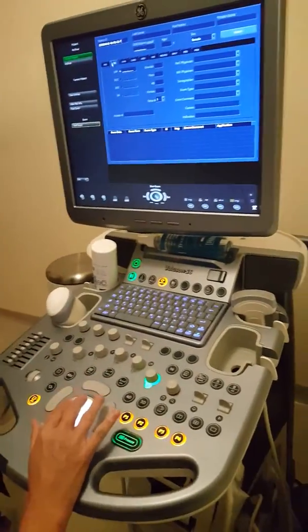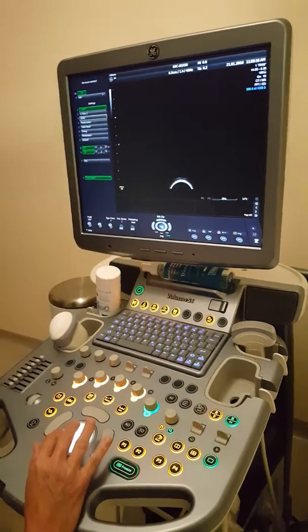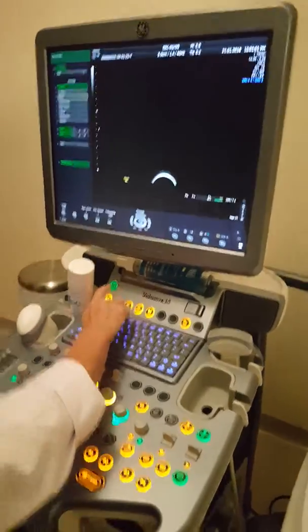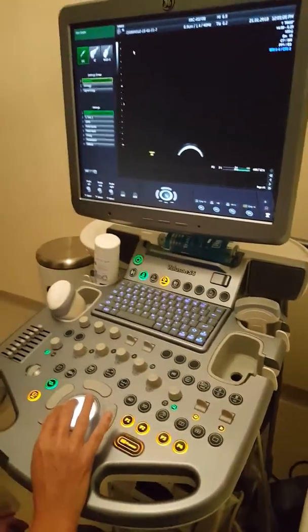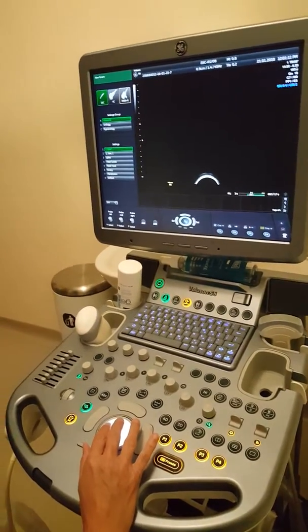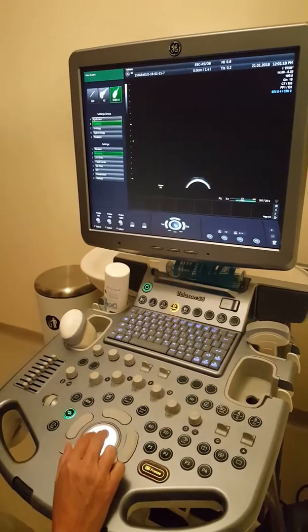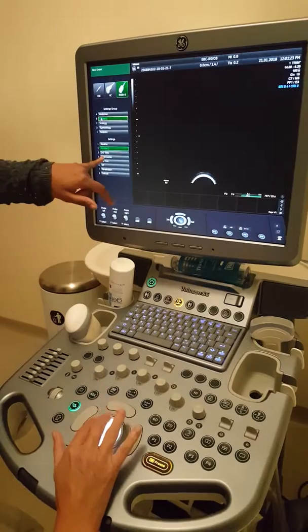So where did I go to obstetric? Obstetrics, doctor. And then Start. I did go because you want to later change the probe, is it? Yes. Probe, doctor. Good probe. It's the important button. And I know in general I think the picture is nicer with this one. So I have to use it more. I didn't have that in my first job, only in Gibraltar. Okay, but I'm in obstetric, but I'm a bit later in the pregnancy, normally. Trimester 2 plus 3.